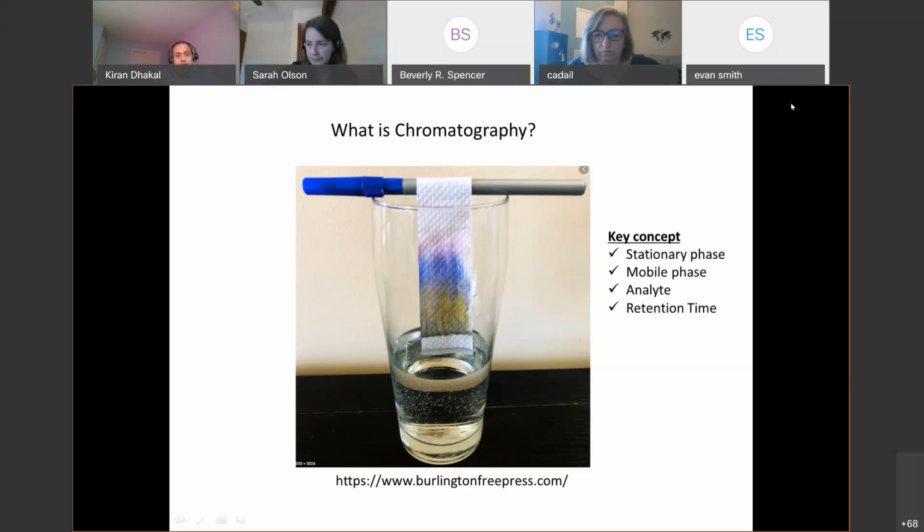And your black dark marker will slowly separate into different colors. You can see here that black line when it is dipped in the water, slowly separating into yellow, blue and some purple color. So chromatography is separation of colors, and this principle is utilized by companies to make the chromatography material.